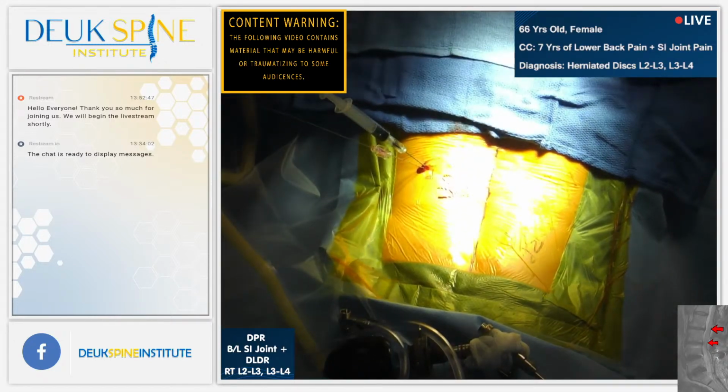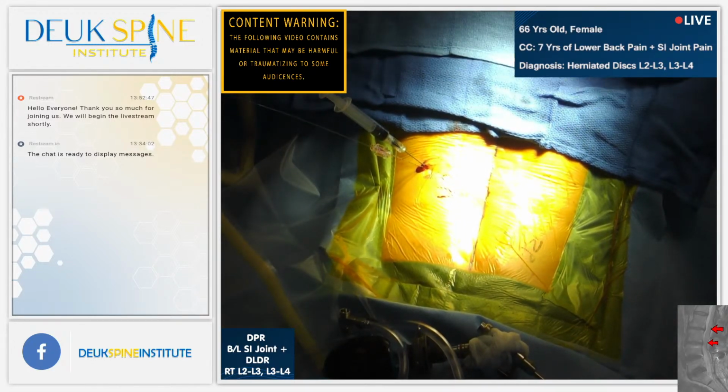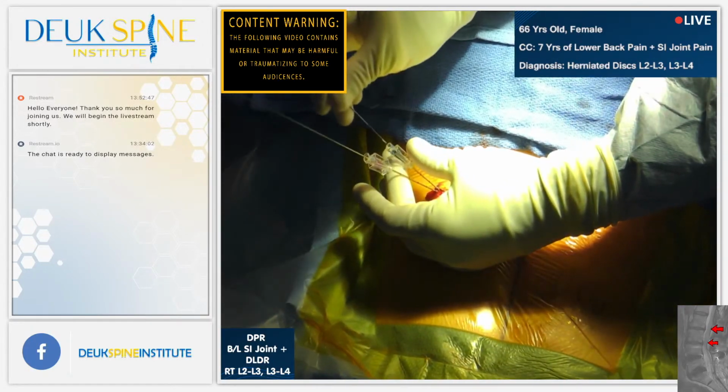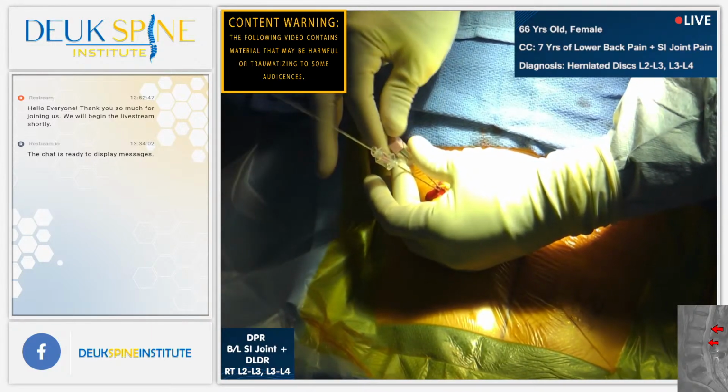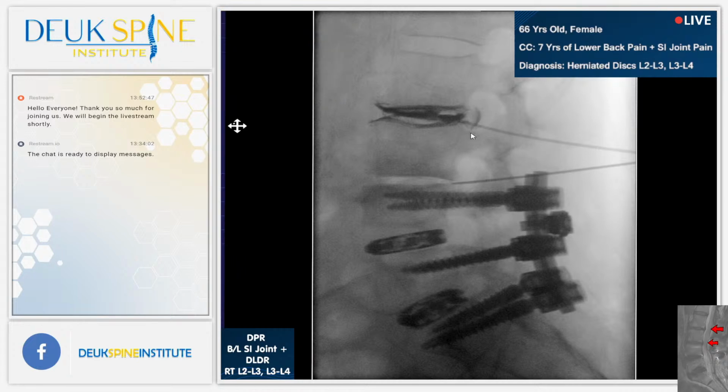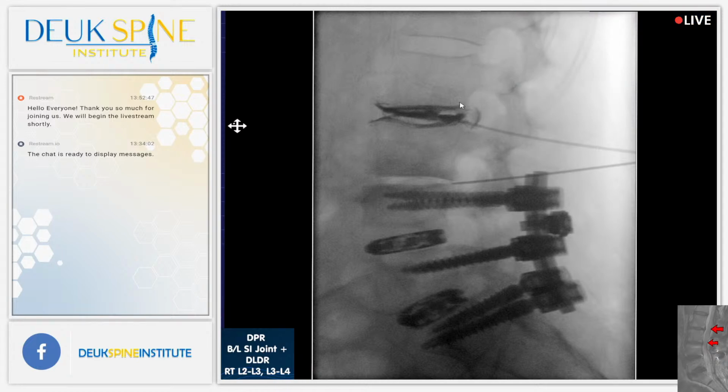So L2-3 is 10/10 concordant, her typical pain. I couldn't get L3-4 done, but we're going to fix it anyway. You could see the herniated disc. Show them the herniated disc, Jordan. You guys see the herniated disc at 2-3 where we did the discogram? The dye is coming around the disc there. Now, Dr. Berndes made a great point. The foramen, show us the foramen where the nerve leaves. Circle the whole thing. It's that big white thing. Totally wide open. So that's why she doesn't have leg pain, because she has a big foramen. But she has back pain. We're going to fix that today.